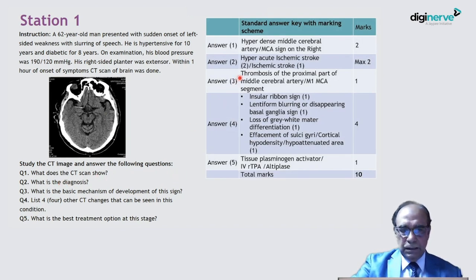For the first question CT findings, there is a hyperdense middle cerebral artery sign. This is sign. Hyperdense middle cerebral artery sign, or you can write MCA sign on the right.